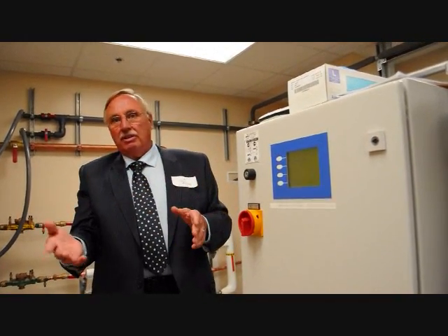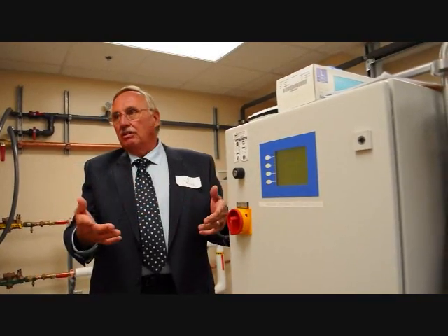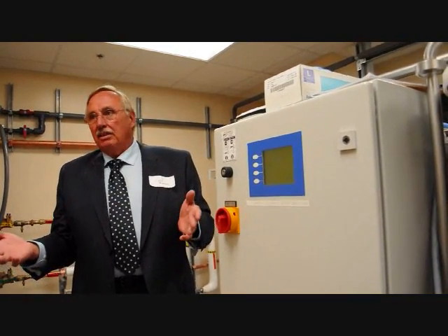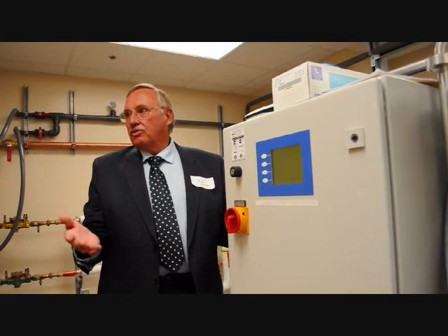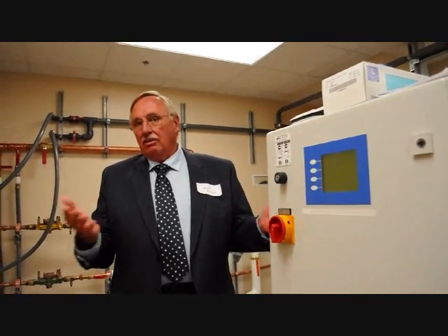It then goes through a cooling cycle that allows it to cool, and the system is up and ready again for the next morning's runs, so that we can treat the patients and make sure that all of the water is ultra-pure all the time.